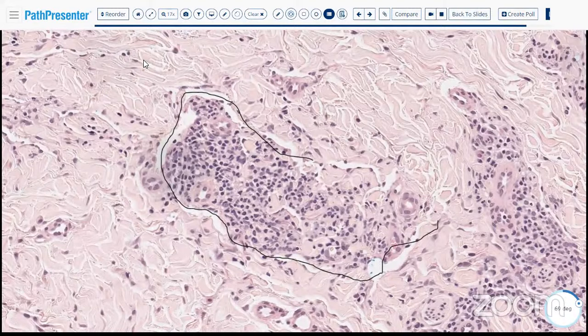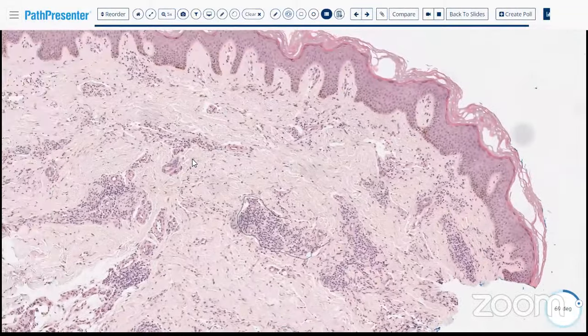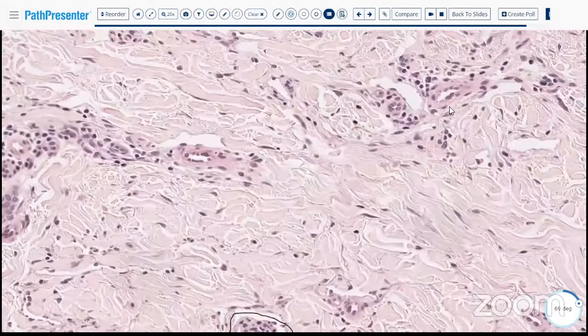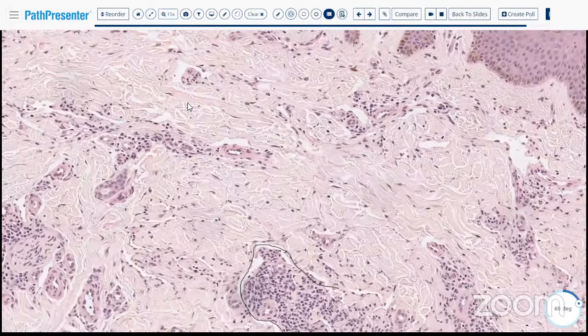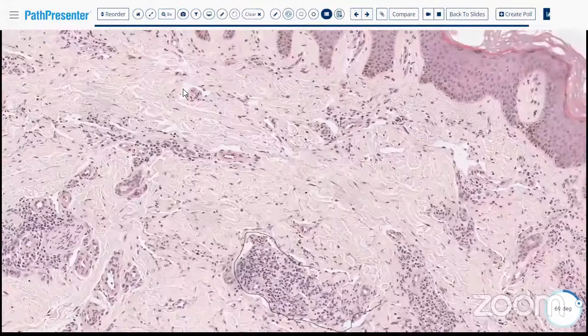And in fact, those cracks actually form around pre-existing structures. So what happens is our endothelial cells in Kaposi sarcoma start to wrap around everything. They dissect the collagen. They come across something that was there, like a vascular plexus or a follicle, and they will wrap and wrap and wrap until the cracks jut around the pre-existing structures. That's known as the promontory sign. Now that we are familiar with it, we'll really see it everywhere we look. Here's a nice promontory, with spaces wrapping around pre-existing structures that then jut out into the space. So this is Kaposi sarcoma.